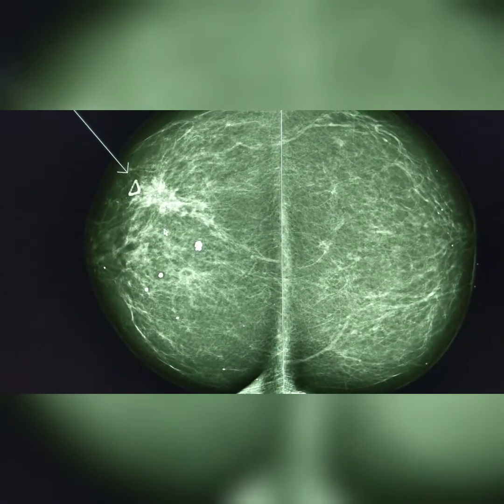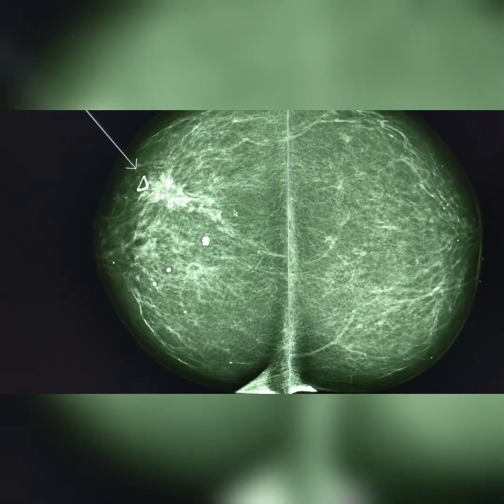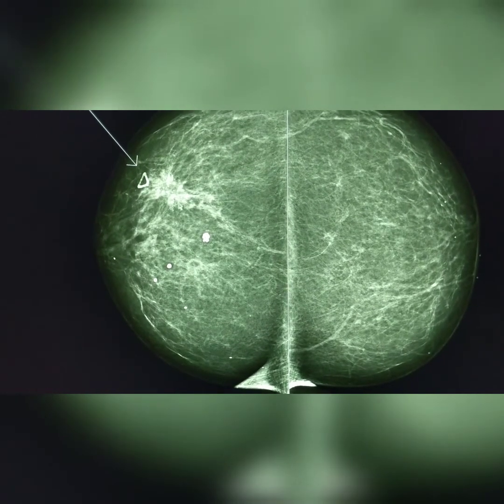And in radiology, basically, symmetry is your friend. So this is the right breast, and this is her left breast. You can see there's an obvious asymmetry between the two sides in terms of this tissue.